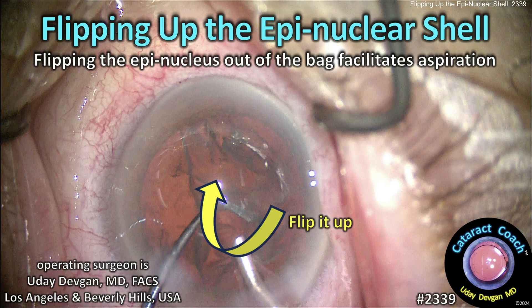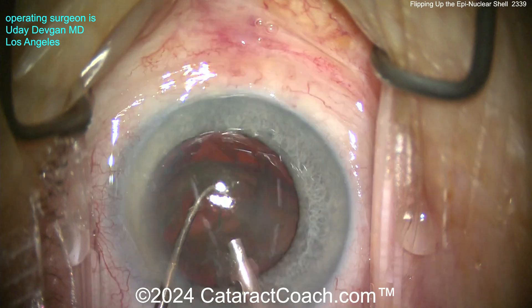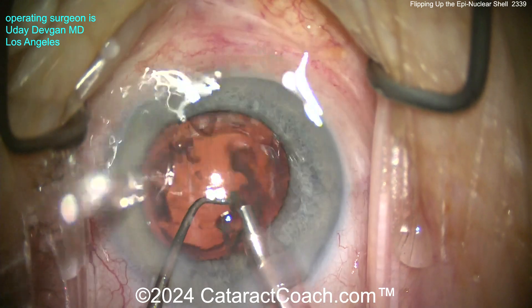CataractCoach.com — flipping up the epinuclear shell. If you flip it up out of the capsular bag, it really facilitates aspiration. Let me show you what I mean with a couple of quick clips. Here's a case of me operating: this is a big epinuclear shell, and if I get it like this and use the chopper, I'm flipping it over — by flipping it, it just makes it so easy to aspirate.